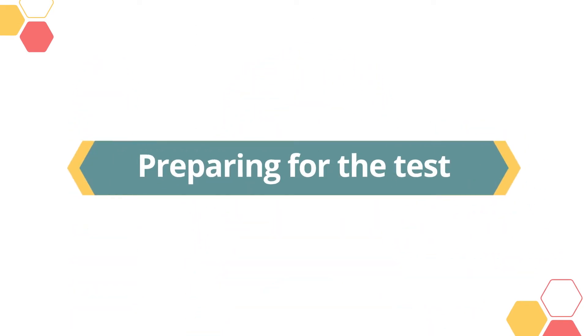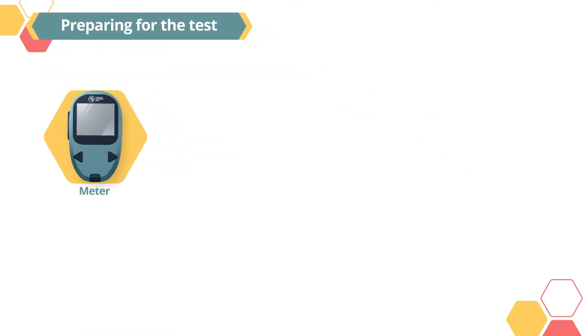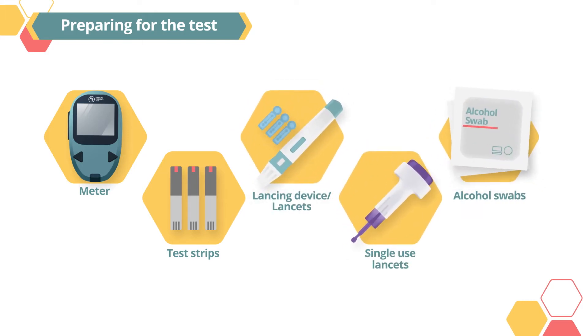Preparing for the test. You need the following items ready before carrying out the test: your meter, test strips suitable for your meter, a lancing device with lancets or single-use lancets, and alcohol swabs.